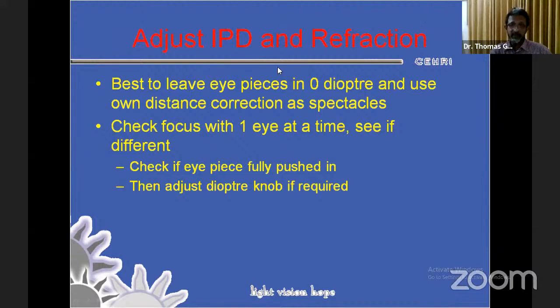IPD and refraction have to be adjusted for. It's always best if you're wearing spectacles, wear spectacles with your distance correction in place and use the eyepieces at 0 diopter rather than keep changing it and taking off your glasses. It's just like driving. If you've learned to drive with shoes, it's much more convenient, but some people have learned to drive with barefoot, and it is a bit of a hassle.